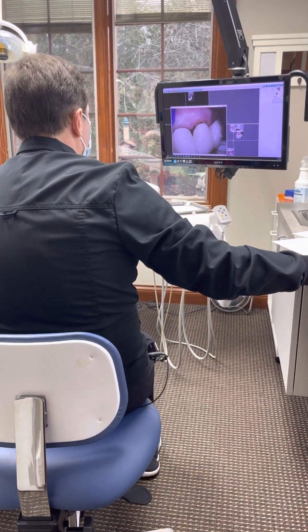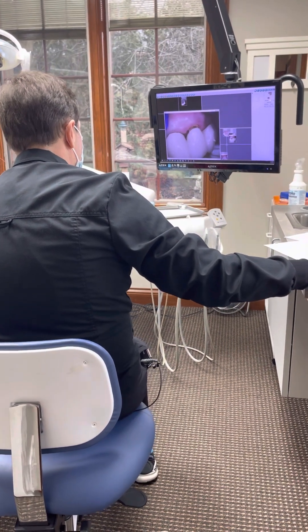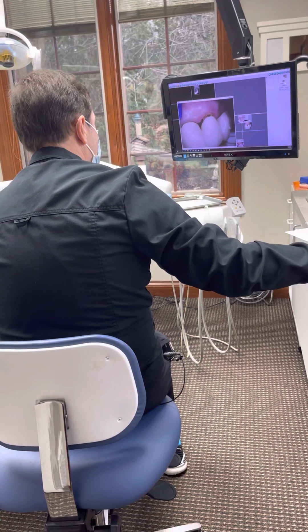Here's the front tooth, there's the side tooth, there's the missing tooth, and then you can kind of see the darkness back there.